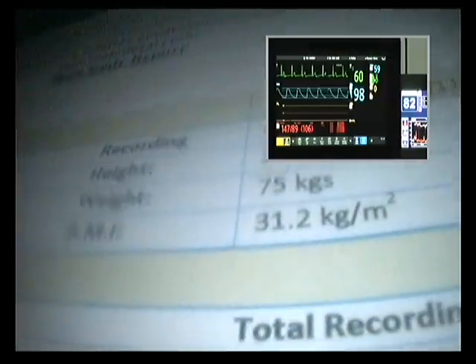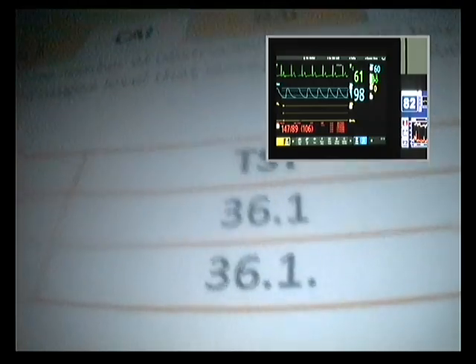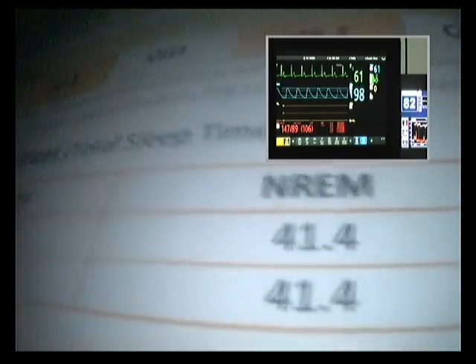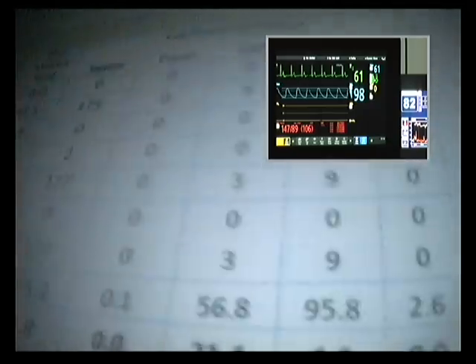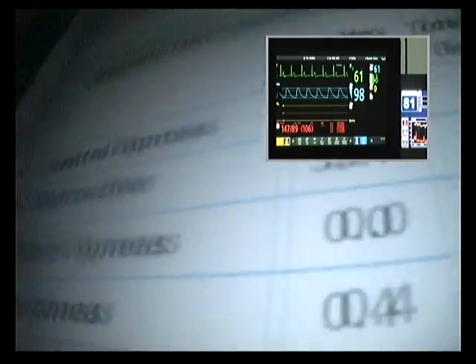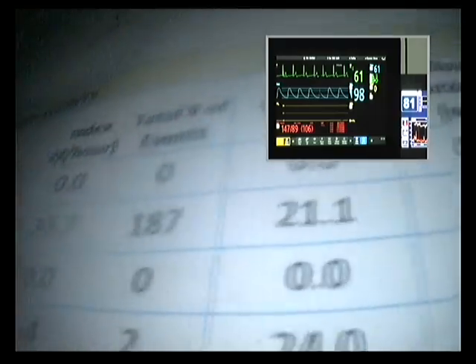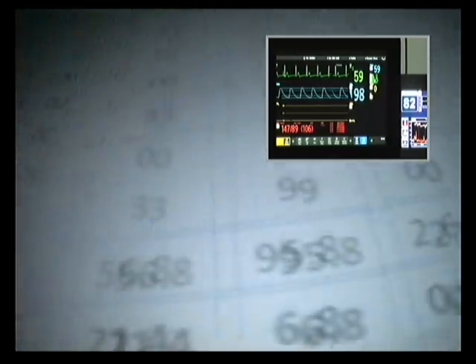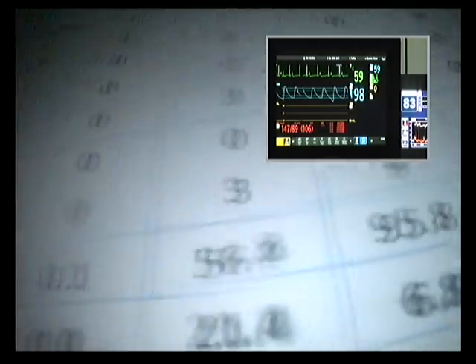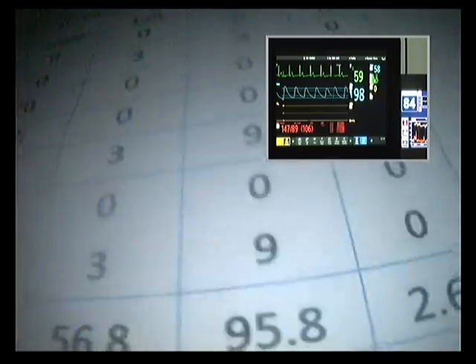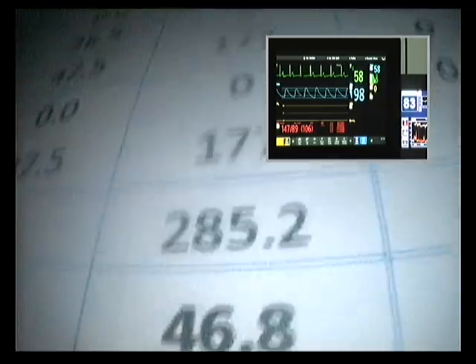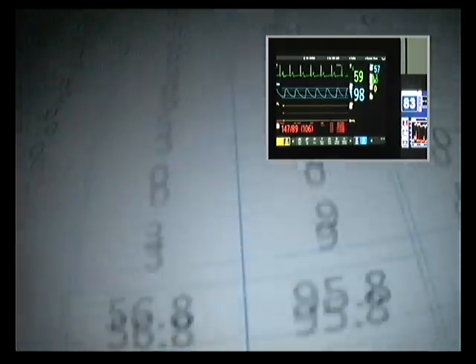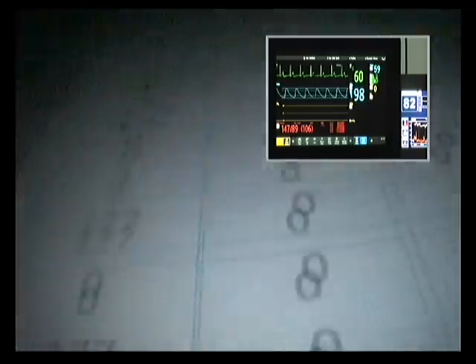Here you are looking at the Drug-Induced Sleep Endoscopy of a 48-year-old male whose BMI is 31.2 and whose AHI in total sleep time is 36, non-REM is 41 and REM is only 10, so it's mostly obstructive apneas. He has mostly slept supine and has the maximum events in the supine position, some on the right, a little less on the left, nothing in the prone — he has not actually slept prone.